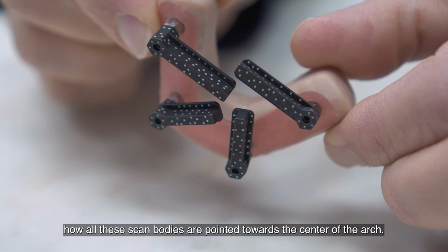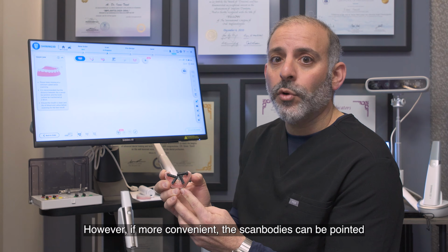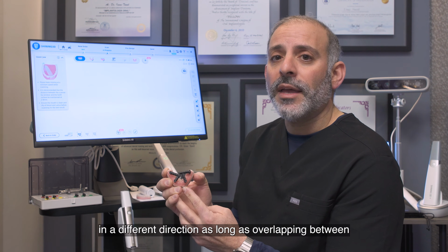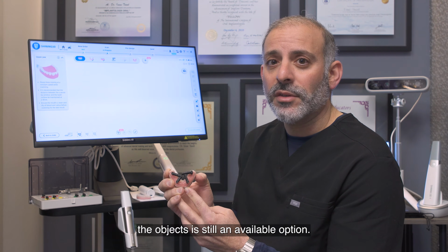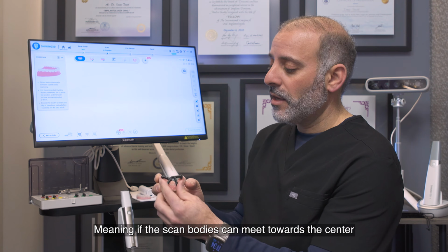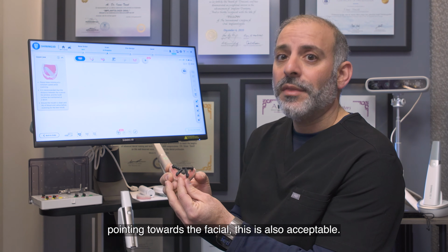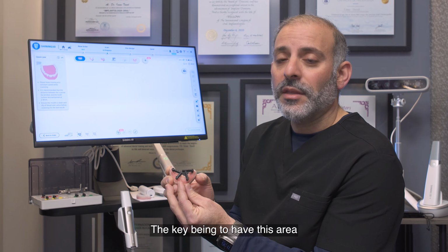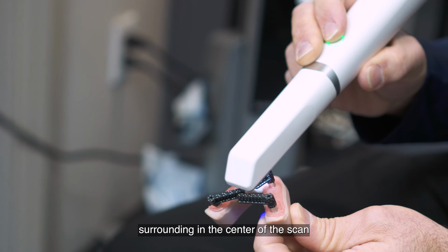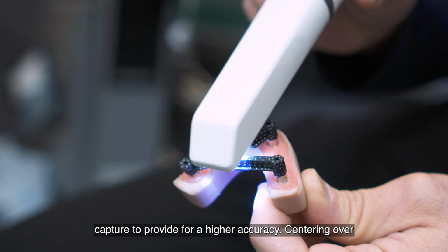Notice how all these Scanbodies are pointed towards the center of the arch. However, if more convenient, the Scanbodies can be pointed in a different direction as long as overlapping between the objects is still an available option. Meaning, if the Scanbodies can meet towards the center pointing towards the facial, this is also acceptable. The key is to have this area surrounding the center of the scan capture to provide for higher accuracy.